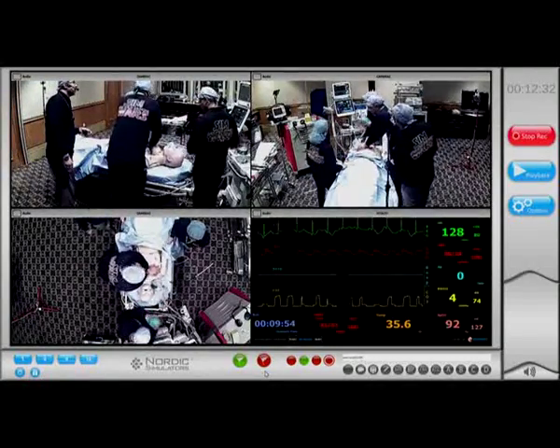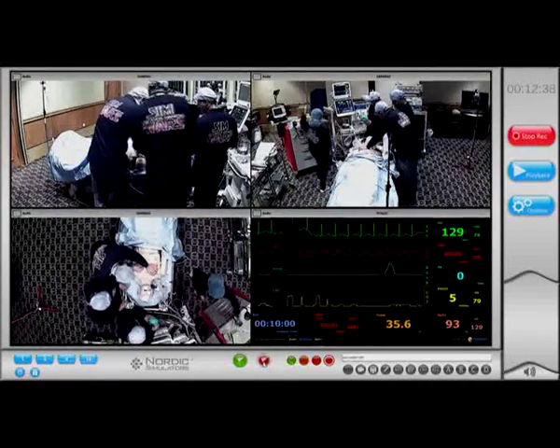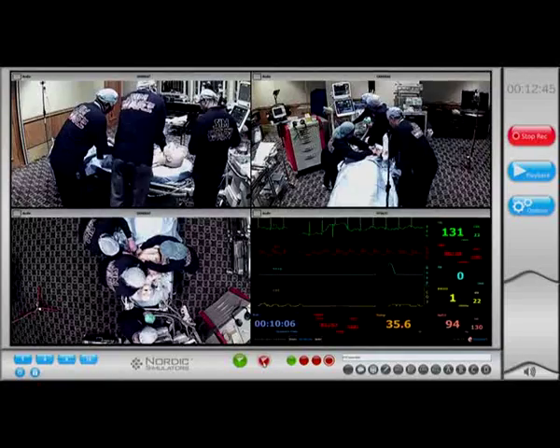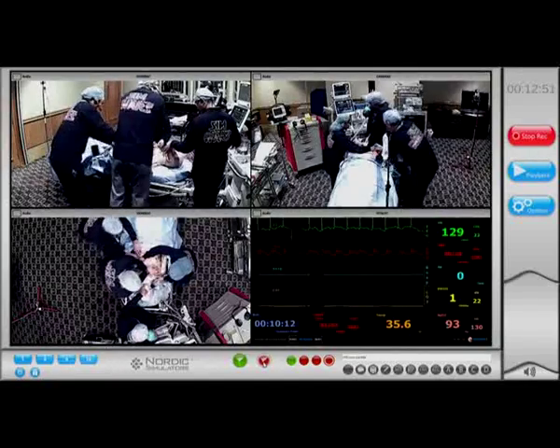Stop. Where is the ECG lead? If not, I will continue till we connect the ECG. Connect the ECG leads. Someone get the ECG leads, please. We want to minimize the interruption of chest compression, please. I think Laji started to improve oxygenation a little bit after insertion of the chest tube. Saturation now is 81. Good.